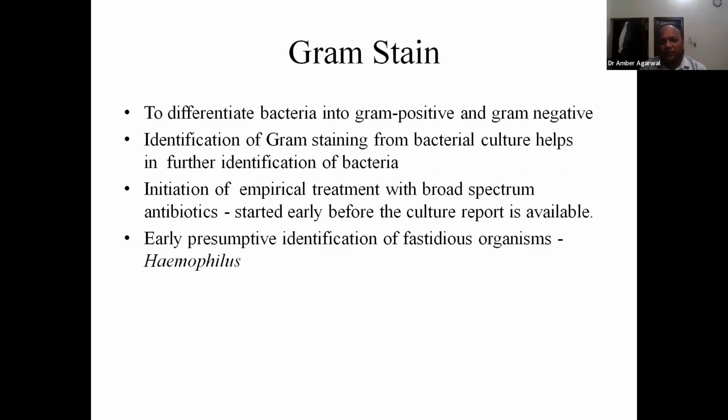Now, what are the uses? For example, let's say we have got a pus sample for culture. So we have plated into our different medias. Most commonly used medias are blood agar and a differential media, that is MacConkey agar.